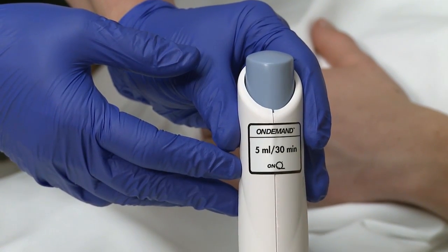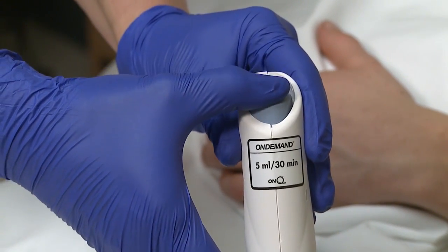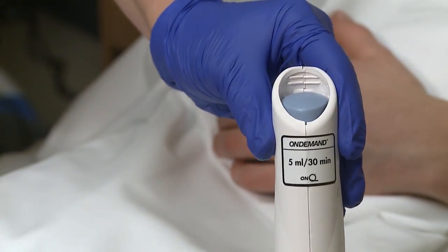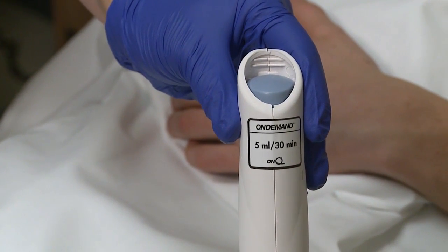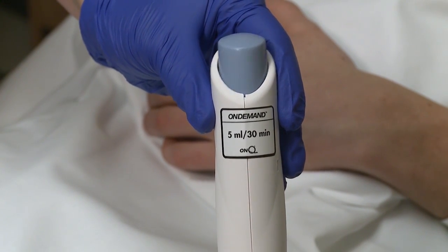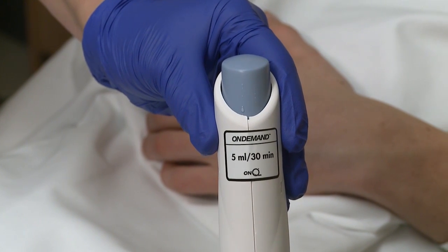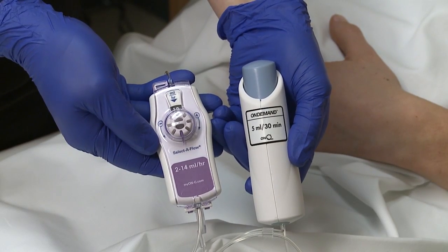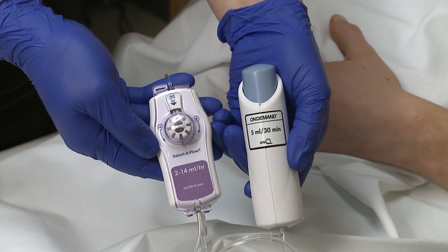This squeeze button is available to you if you have breakthrough pain and need a little extra numbing medicine. Simply squeeze the button on the demand bolus device and it will give you 5 milliliters of additional local anesthetic. As this automatically refills, it makes a clicking sound, providing you an extra dose of numbing medicine every 30 minutes. However, if you are using it frequently, you may be better served by turning up the rate some to maintain a better level of numbness.